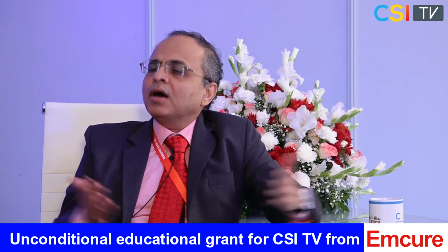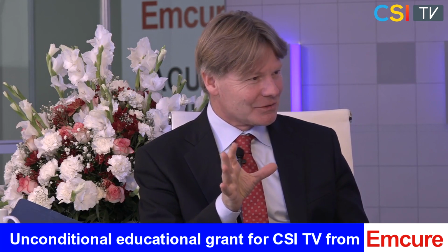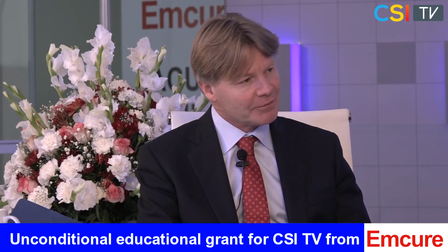Now from the clinical cardiologist's perspective, what is the role of calcium scoring of the coronaries for risk stratification of an asymptomatic individual? When should a clinician ask for a CT calcium score and how does it impact decision making in managing the patient? Dr. Jeroen? Okay, so the calcium score is the easiest way of looking at the CT scan. You just look at the amount of calcium present.